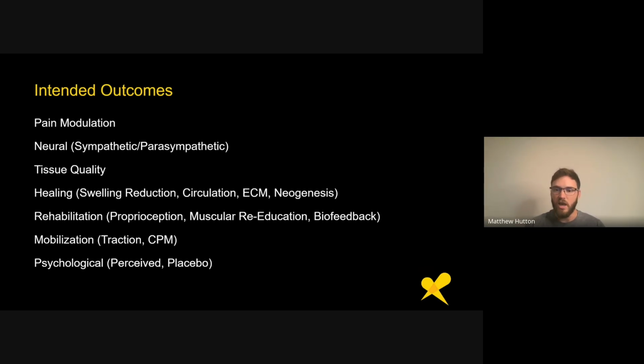So yes, the electrical component, the third party contraction like we were saying, is just there to help the body relearn it. Very cool.